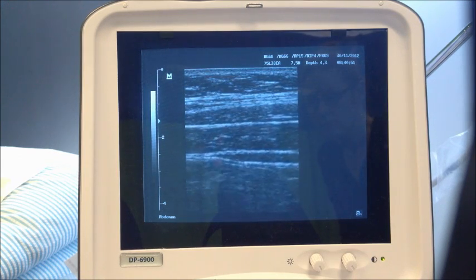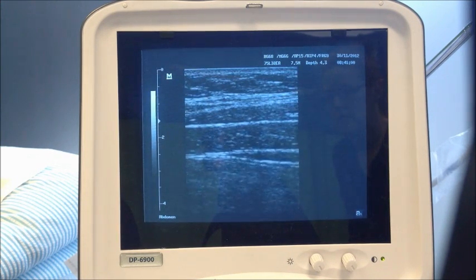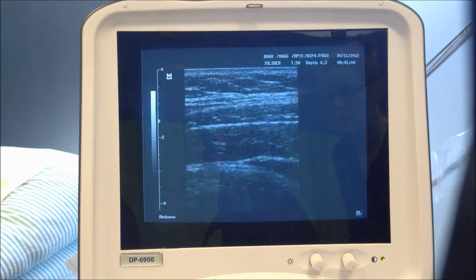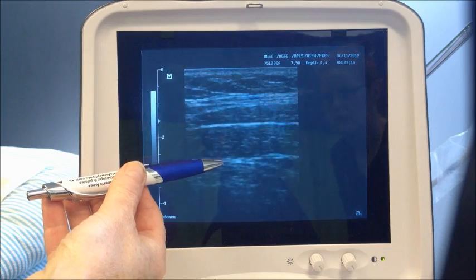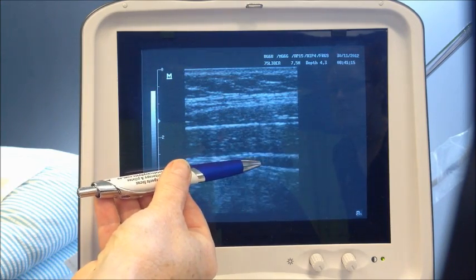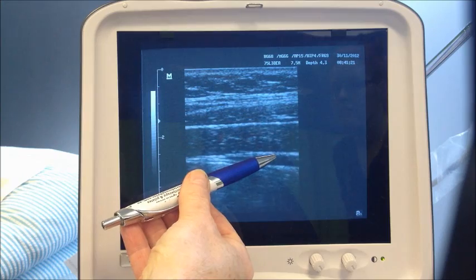Okay, so now this time what I'd like you to do, Christina, is just continue to breathe normally if you can, and then when you're ready, I want you to gently just try and tighten your deep, low tummy. Hold, and now relax. Let go. So what we see there is the thickening of this transverse abdominal muscle, and it's moving from its resting position there around towards the spine.